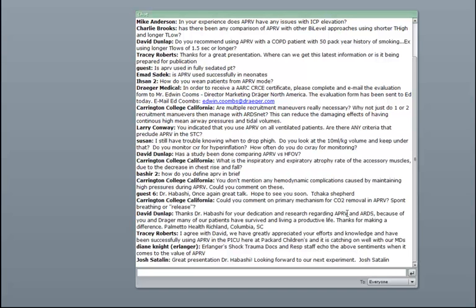What we didn't really pay attention to is the fact that the minute ventilation was higher and the airway pressure was higher. In other words, we would switch from a CPAP of 15, and then over time, as they collapsed their bases, we would find that we'd be back up to pressure support of 20, 25, and the minute ventilation was much higher. So anytime you switch, look at the cost of ventilation. It's not just the blood gas. You always have to interpret a blood gas with what it costs you to ventilate the patient.